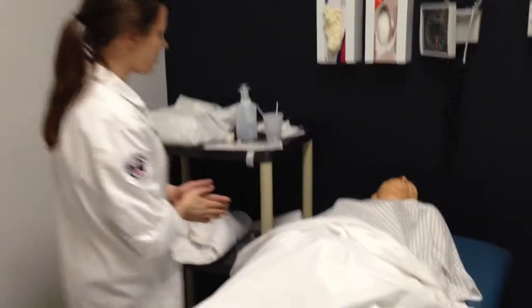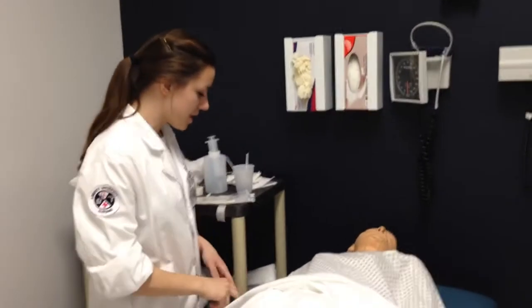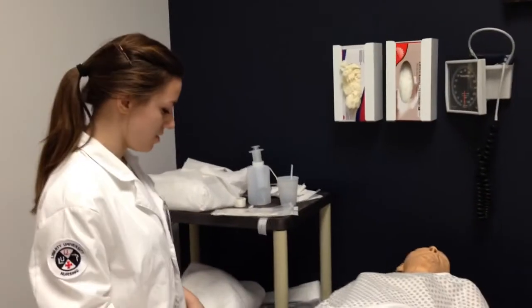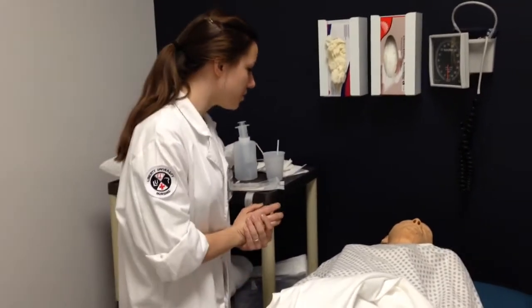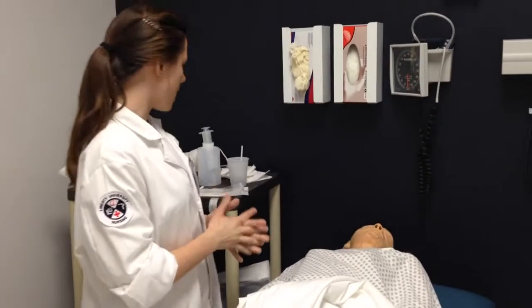Hi, my name is Ashland Walls. I'm a Liberty nursing student. I'm going to be your nurse for the day. Can I please have you state your name, first and last, and your date of birth? Alright, thank you, Mr. Smith. So today what we're going to be doing is putting an NG tube down for you.